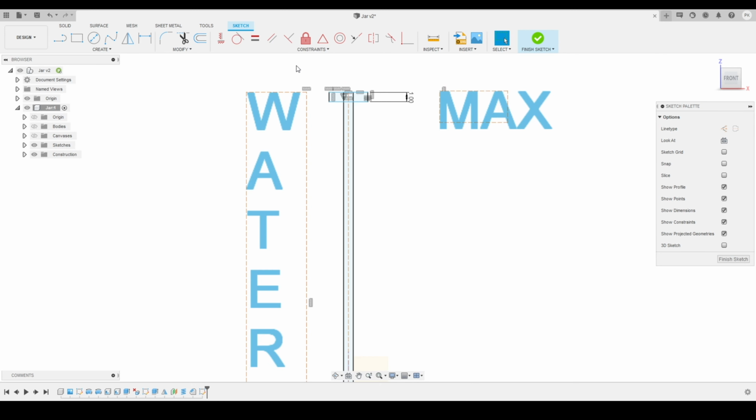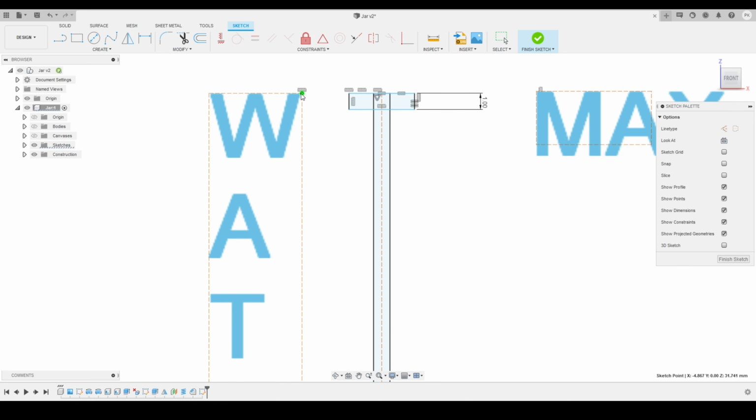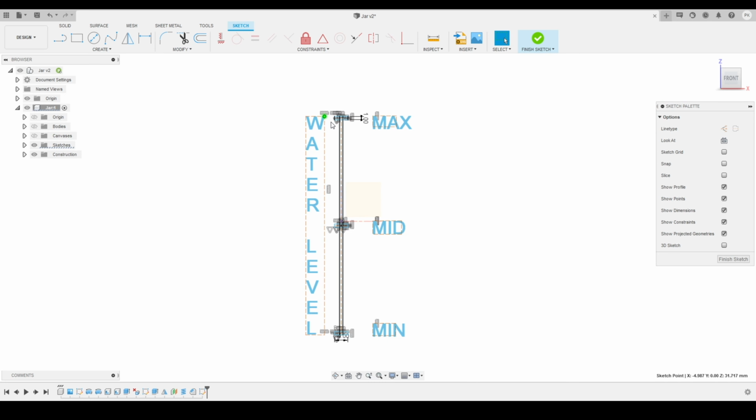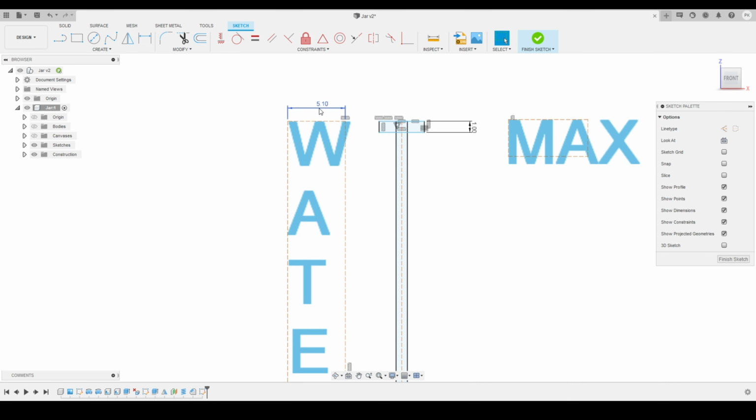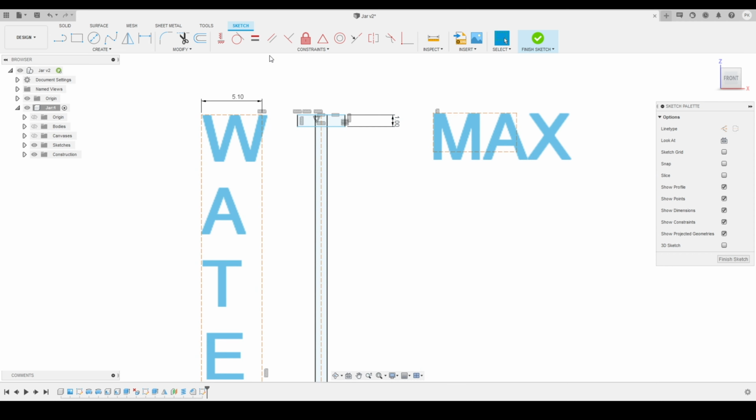So I had applied the constraint, and now I will adjust it a little bit more to make it look good. And here you can see I will go to the dimension tool and define the width of this text box. So then our drawing will be more defined, and we'll follow the same process. We'll define the position of this text box from this point to this point. I just want to keep 3 millimeters away from these markings, and we'll do the same on the other side. For the other side of the text, we'll change that to 3 millimeters.